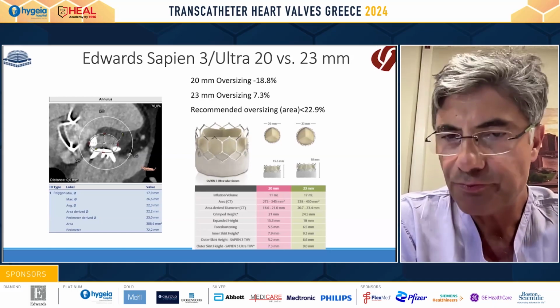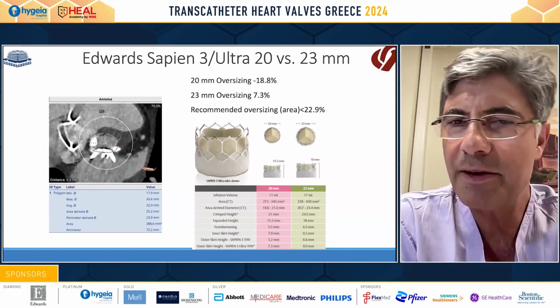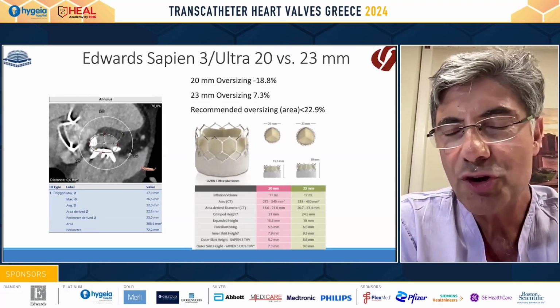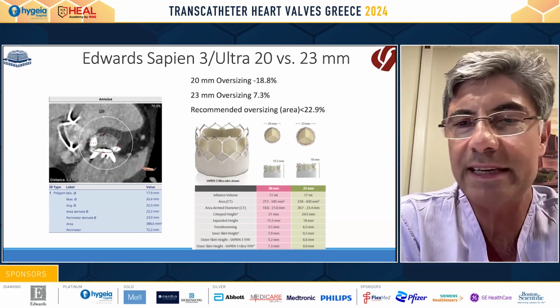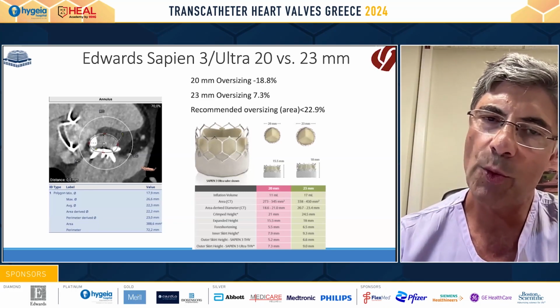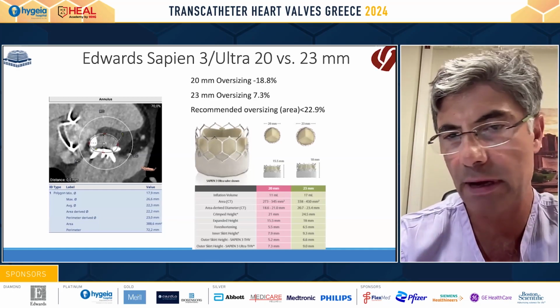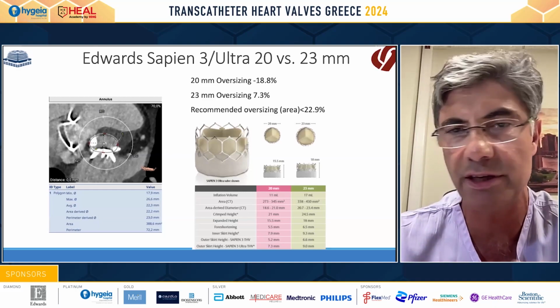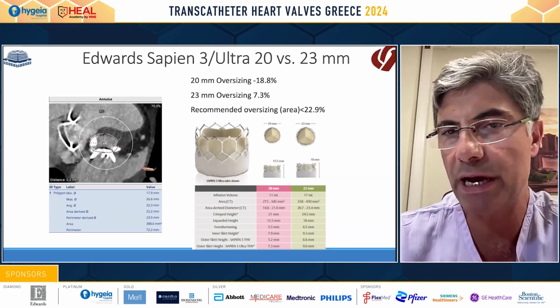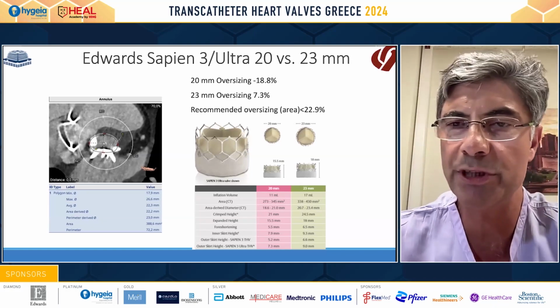As Dr. Velianou said before, and I followed his discussion with great attention, he said that we need to have a surgical-like approach, and this is our aim in this kind of situations. So we decided to place a balloon expandable valve, and I don't know if there's any comment from the audience, if someone would go ahead and place a self-expanding valve due to the hemodynamically superior performance. So George, what's your opinion on that?